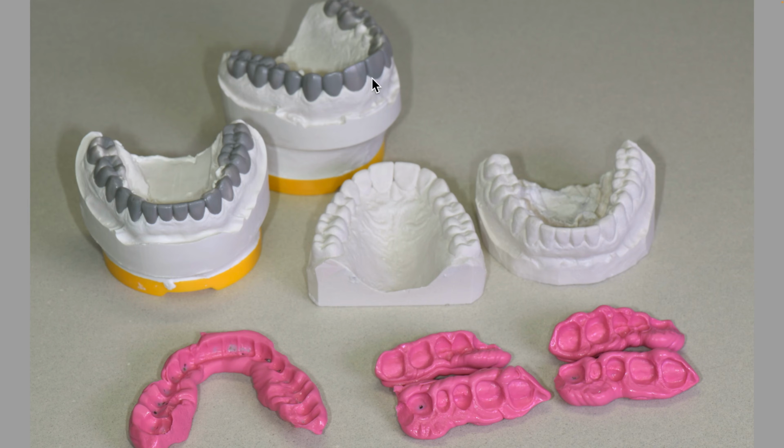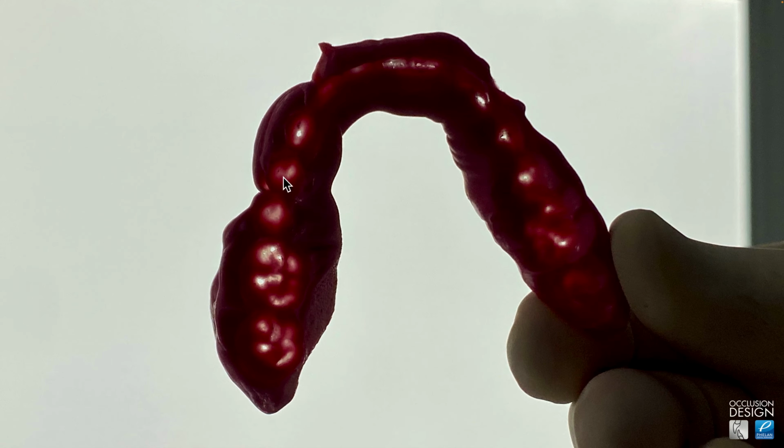You can see a better image of the wax ups. And this is the provisional model here, upper and lower. So we send all this to Harold. He'll cross-mount everything to the mounted models, cross-mount the prep models with these bites, the upper prep anyway, and get everything ready to go to build the porcelain restorations. You can see the occlusion on the provisionals here by looking at the provisional to provisional bite, holding it up to a light.